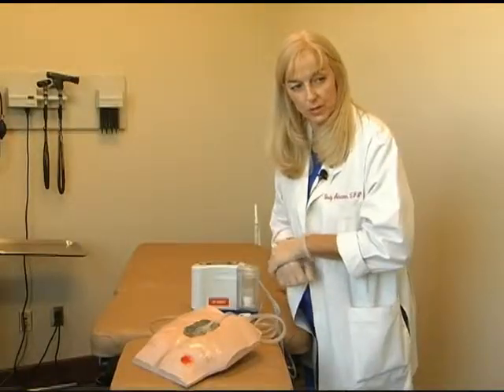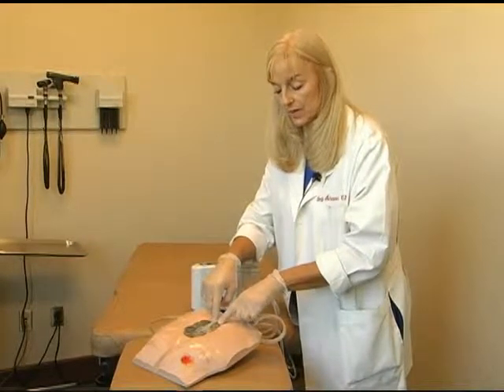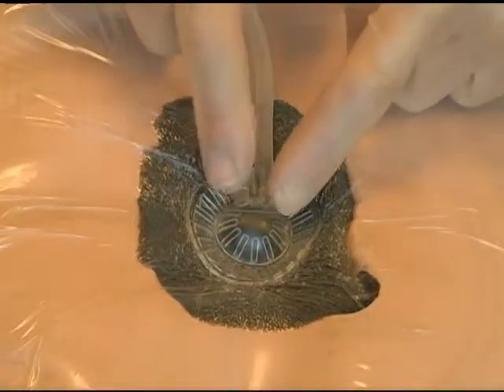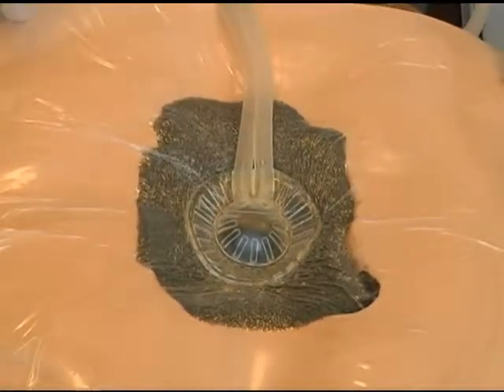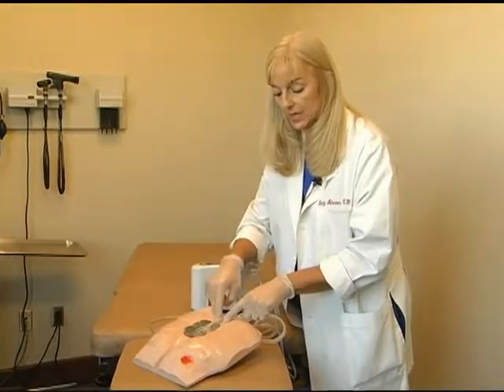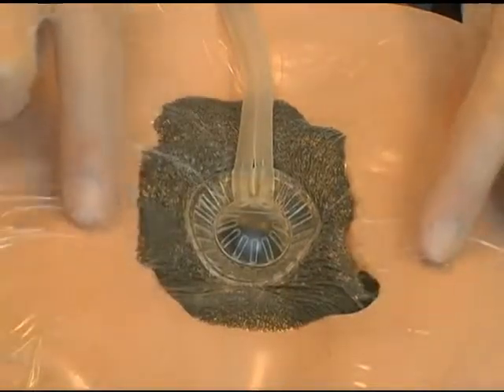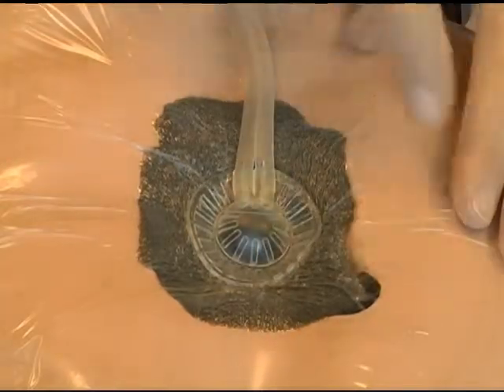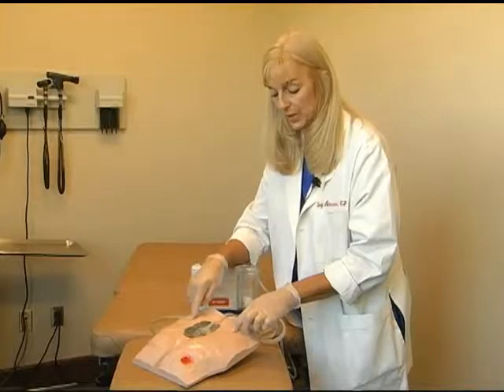Another option, depending on your wound location — for example, on the demonstration model here, this is a sacral wound. If the patient was lying on the wound, we would want to offset the dome to the side or onto a non-bony prominence. Another option available to protect the peri-wound is to place a template dressing or another transparency over the good skin initially, cutting out the wound surface area, then doing your dressing application on top of the template you have built to protect the peri-wound.